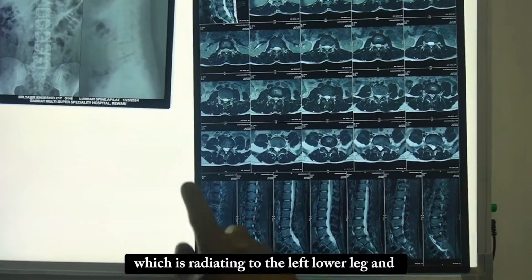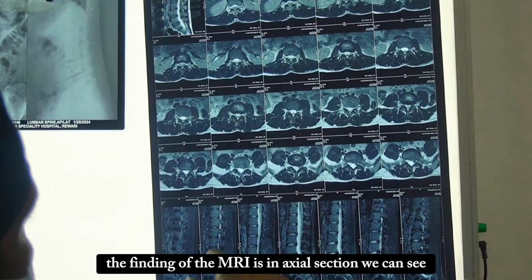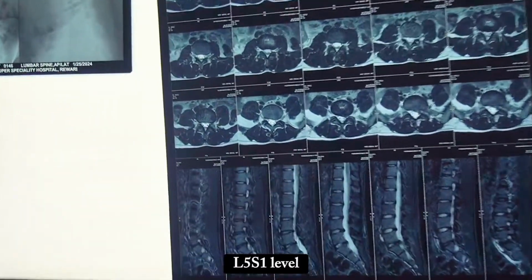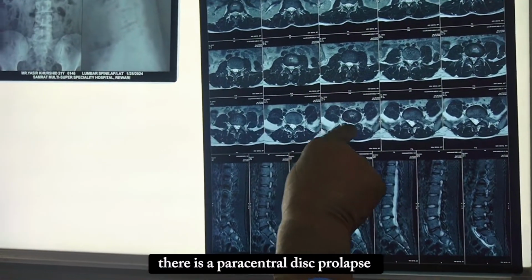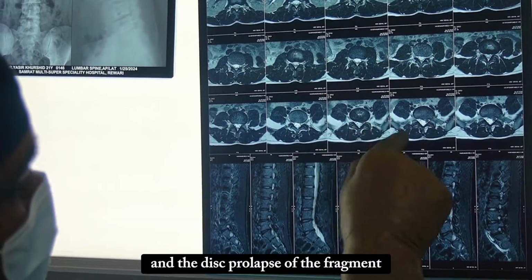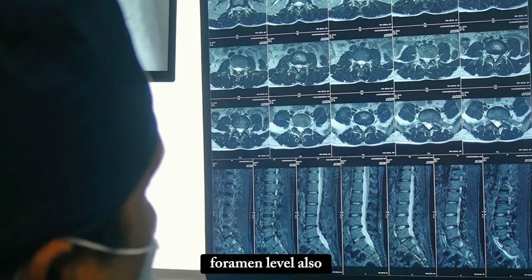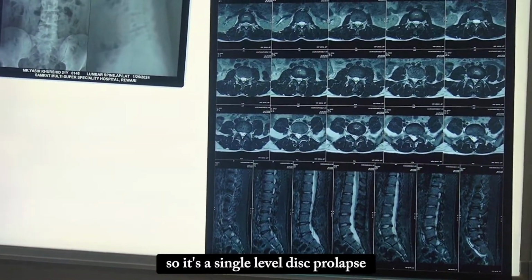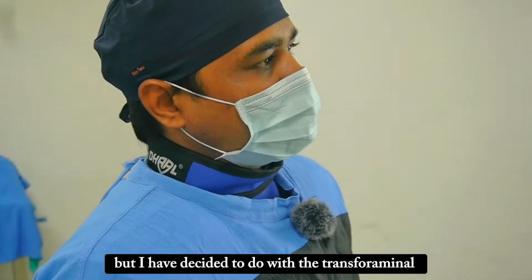When the MRI was done, the finding in the axial section is that at L5S1 level there is a paracentral disc protrusion. We can say very clearly that the disc prolapse, or the fragment of the disc, is reaching up to the foramen level also. So it's a single level disc prolapse.